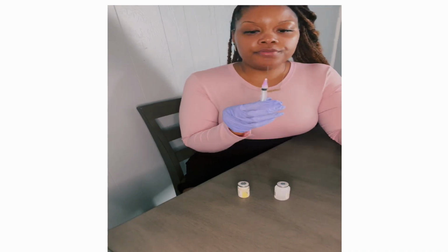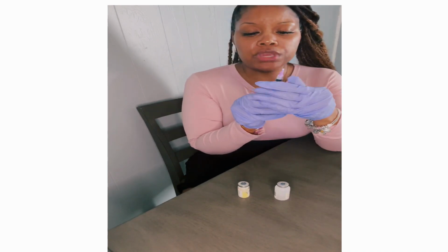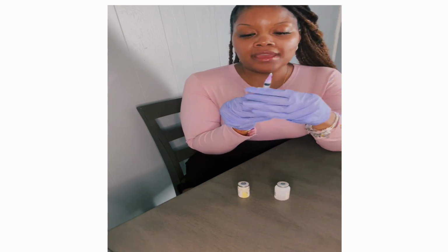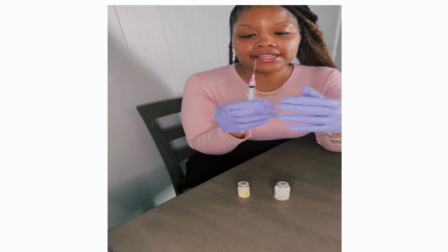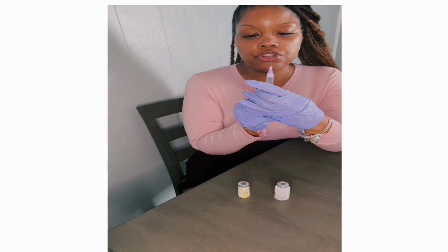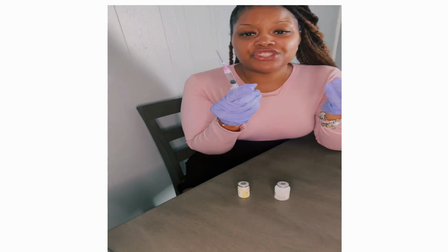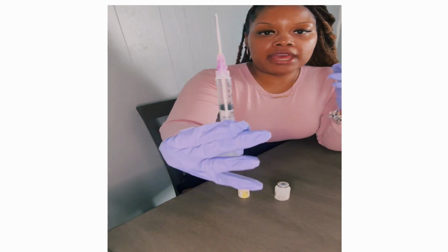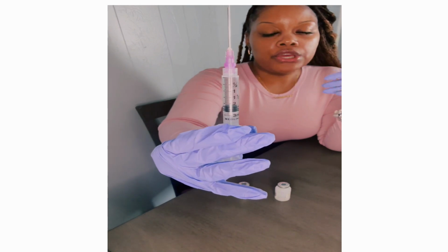All right, so we know that we are going to give 2.2 mLs. So what I like to do is I like to still draw back the 2.2 mLs of air. So you want to get it as accurate as you can. So I'm about right here. That's going to be 2.2 ml.